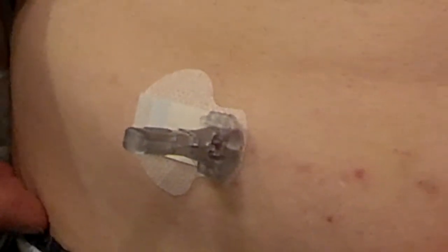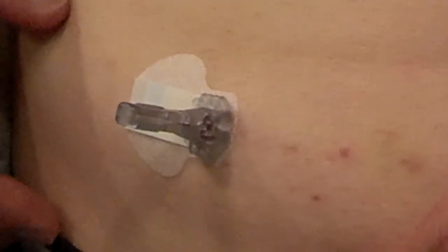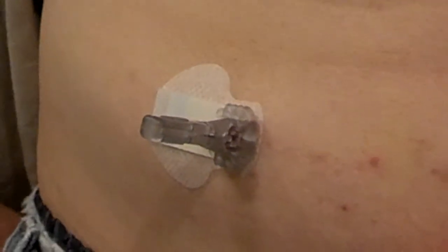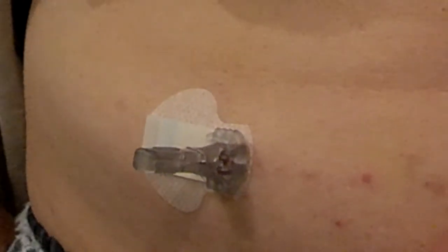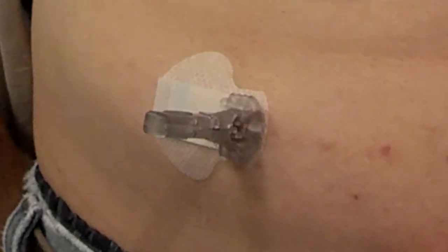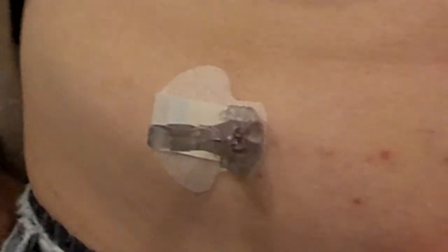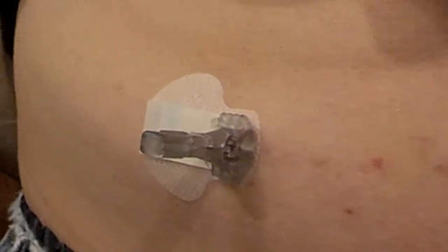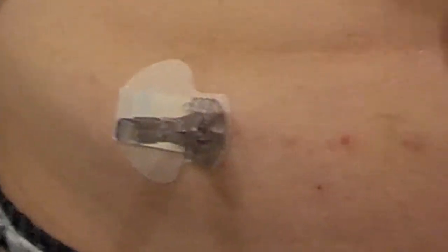I'm having problems with the continuous glucose monitor. I'm taking this video because this is about the fourth time I've had problems with it. I've called and talked to MiniMed about the problem before, and the people I've talked to on the telephone claim they've never had any experience with it. But I've had this problem enough times to know there's got to be a manufacturing problem going on here. If not, I need somebody to explain to me why this is happening.